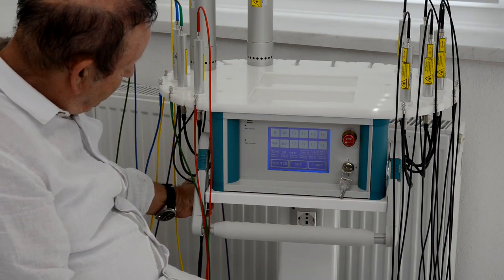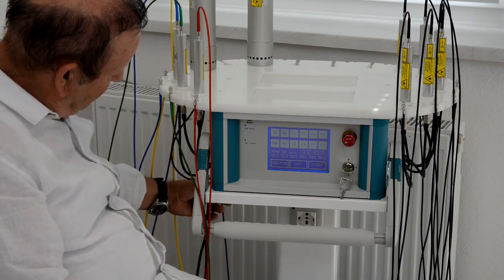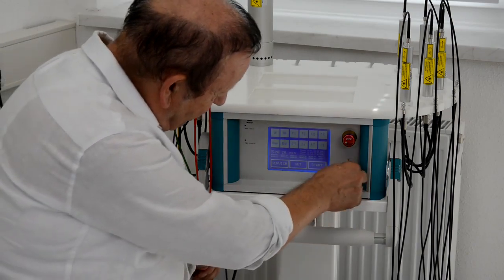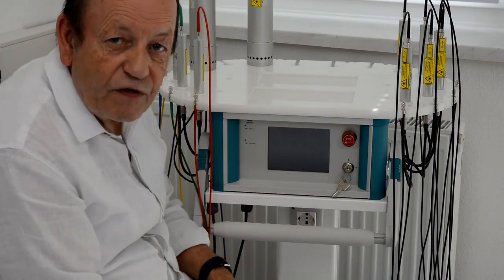So after the therapy, I switch off first the extra power supply. So the fan, the cooling fan stops running, and I turn my key switch and everything is done.